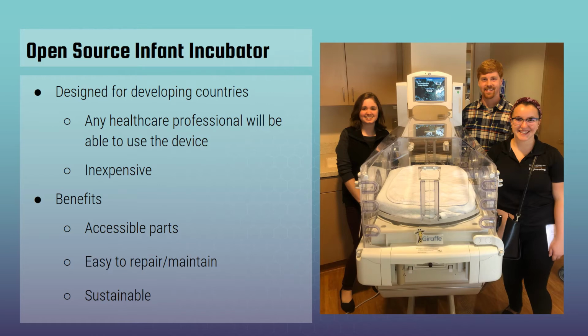Preterm neonate anatomy is not developed enough to regulate their body temperature, which is why they are treated in incubators. Healthcare systems in developing countries do not have access to advanced equipment like state of the art incubators that developed countries like our own have. Often their equipment is old and donated and in disrepair. Repair parts are most often discontinued by the manufacturing companies, and other parts are too expensive for hospitals in developing countries to afford.